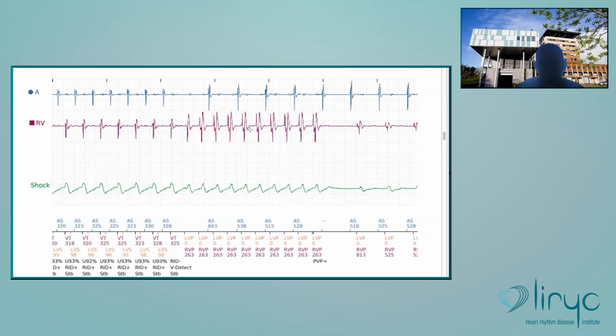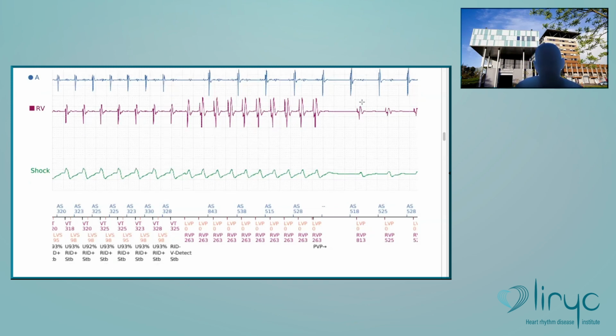Okay, here that's the case of an episode. I will show you another case for this patient, but that's a case of atrial tachycardia and a reduction. So is there a reduction just before, or is this the burst that will reduce it? I don't know, but at least you see that with the ATP, at the end of the ATP, there is no more atrial tachycardia.